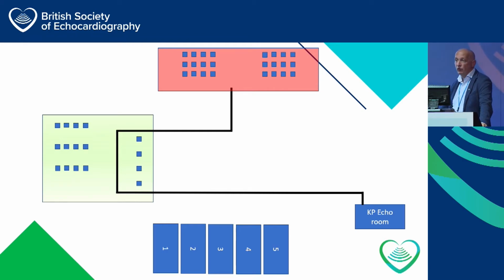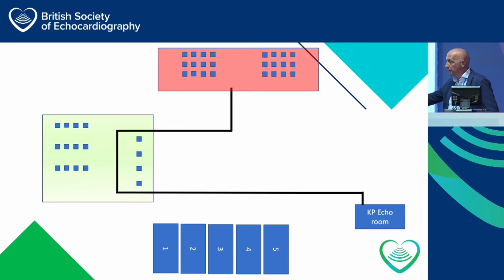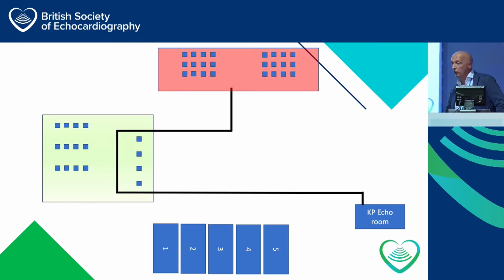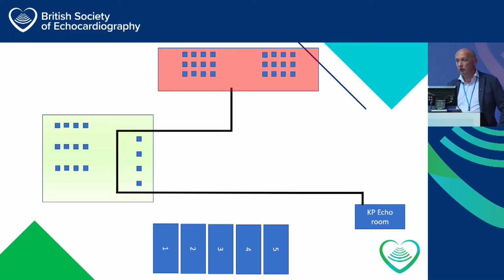And then they have these other things called echo support workers. And they go out and they get the patient, and bring the patient in, and do the height, the weight, the blood pressure, and they put them on the bed, and Wendy goes in and lords it up, and does her bit, and then goes out and does the report. It's great. That's how you get a seamless service.